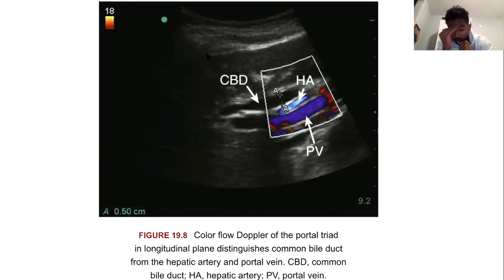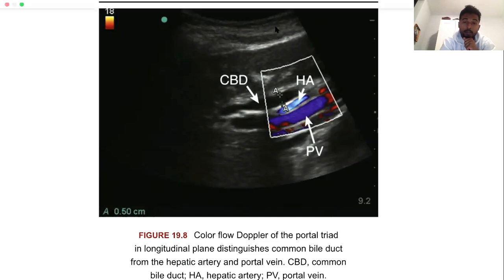So portal blood flow goes anteriorly, as opposed to the marker. The colors on the ultrasound don't, it's not even on the color map. Yeah, because right here it's more towards blue, right? Like purple or something. One, you can't really get the transducer perpendicular to the blood flow like I said, and it's not possible here.